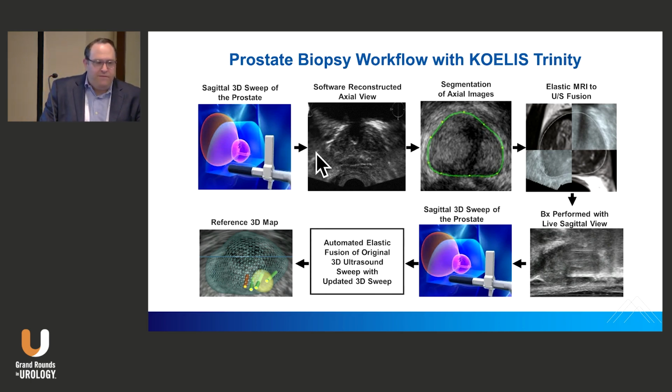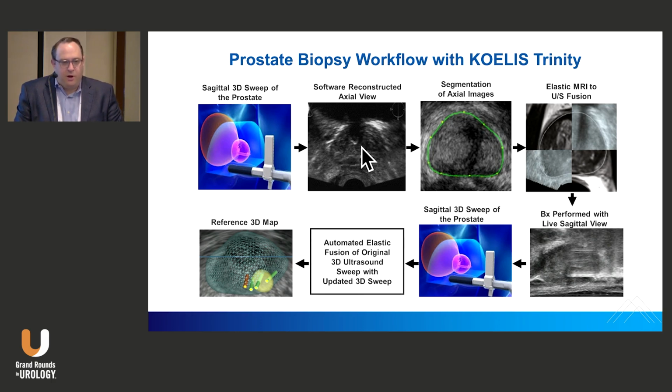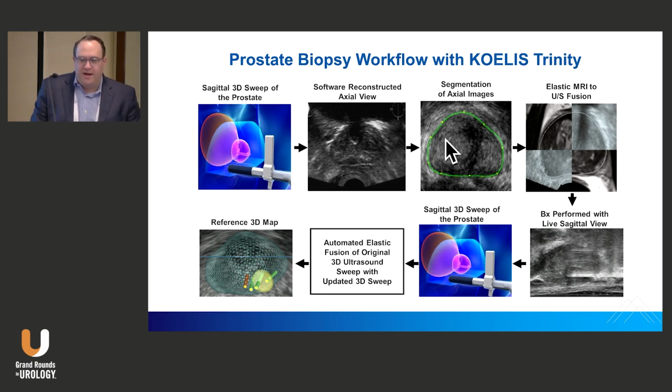So this is a side-fire ultrasound probe that has a motorized head within it. So you don't actually have to rotate the probe to get images of the prostate. You simply put it in the rectum and hold the probe there, press a pedal, and then the ultrasound probe head moves. It depends on how many degrees you set it for, but on average about 210 degrees from left to right, taking a full continuous series of images of the prostate, which can then be reconstructed in 3 planes of view: axial, coronal, and then they're natively acquired in the sagittal view.